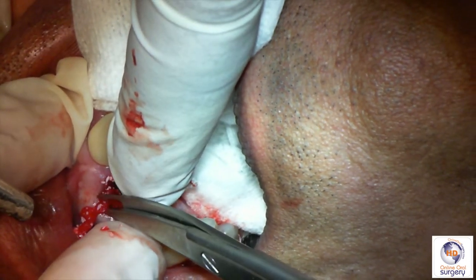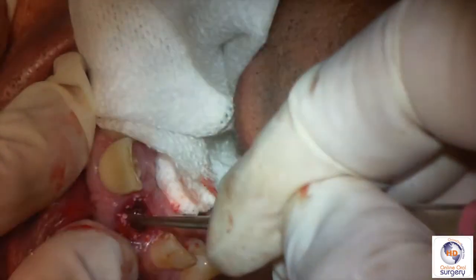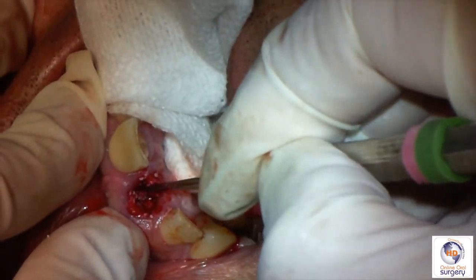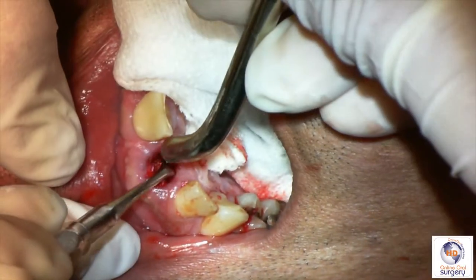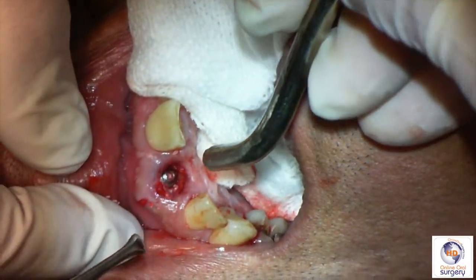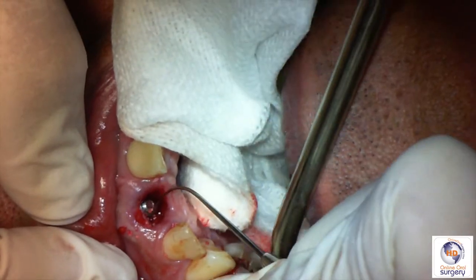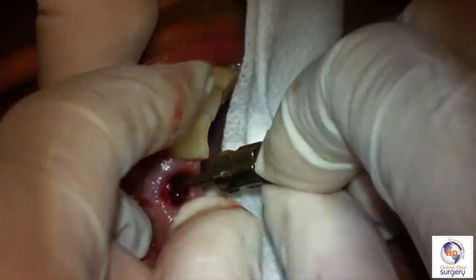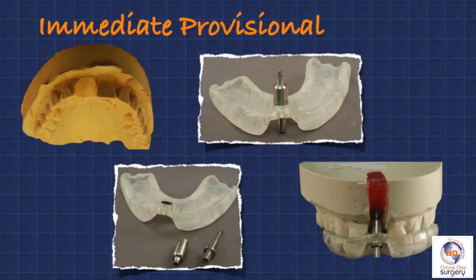Then I go ahead and trim the excess collotape. Once the collotape's been trimmed, we continue to pack the bone graft using the straight curette — the back side of it — and continue to add a little bit more bone until we fill up the alveolus to the top of the implant. Using the suction, we take away the excess carefully, holding the collotape back with the straight curette so that we can do some suctioning and remove the excess particulate bone. I'm also going to remove the bone from inside the screw hole of the cover screw using an explorer. Our plan was to do an immediate provisionalization in this case, and we determined in our implant planning that there was good solid bone all around the implant and we could get good positioning.